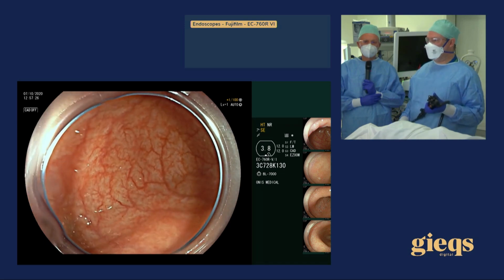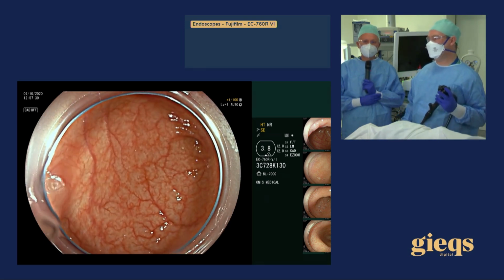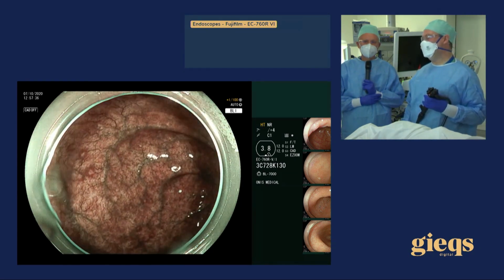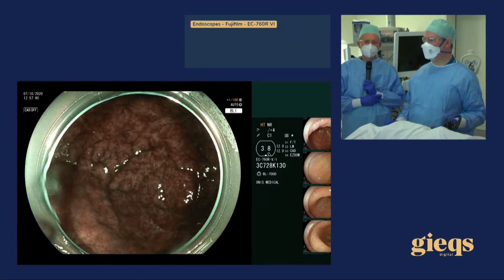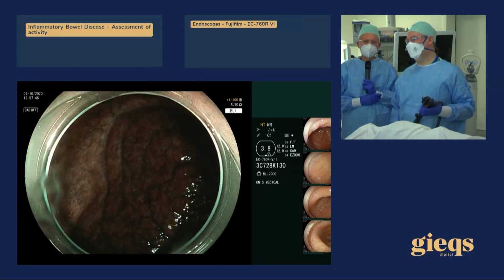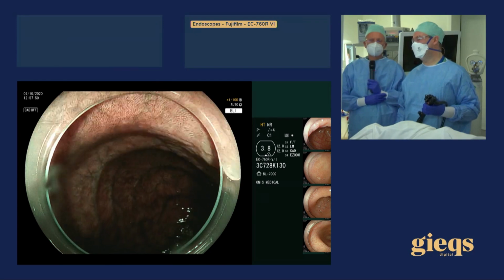Okay, so let's discuss what we could do. Triana, you already alluded to virtual chromoendoscopy versus classical chromoendoscopy. Because the classical interferes with what we do, we're going to show the virtual first. And what we showed in the trial is that this is a very nice way to proceed because it can highlight the lesions and it detects just as many lesions as chromoendoscopy.